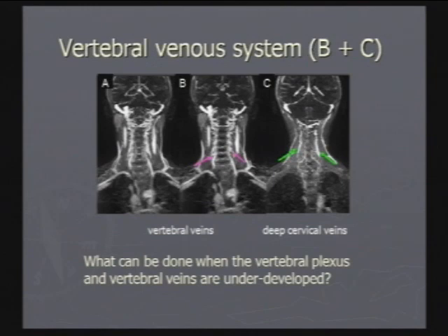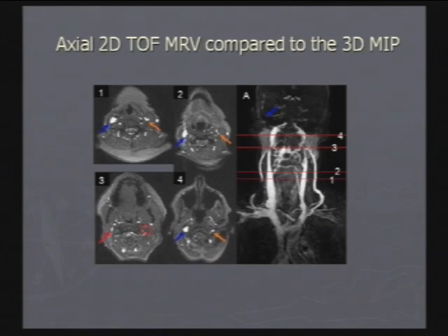Excuse me, I'm going to skip a little bit of this also. I want to show you this image because it shows you that when I think I see a narrowing, I don't just stop and say, okay, that's interesting, it's a narrowing. We take many hours to process this data. We look at it carefully in all orientations. And in this case, we cut through a given region of interest.